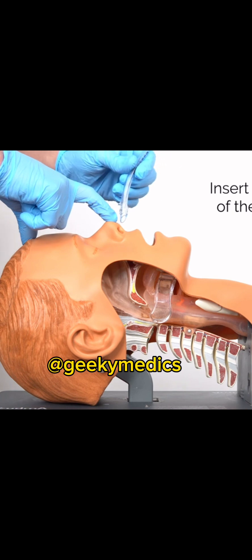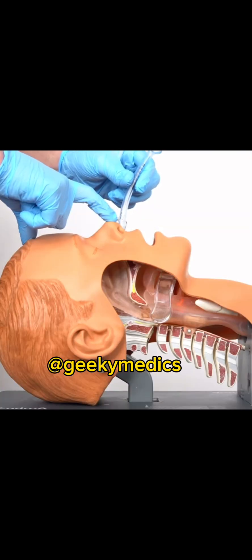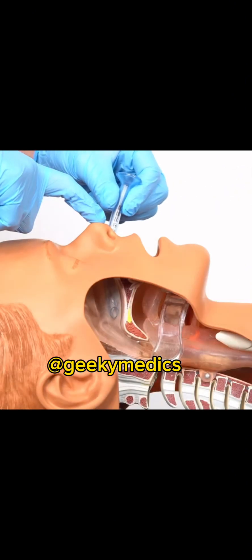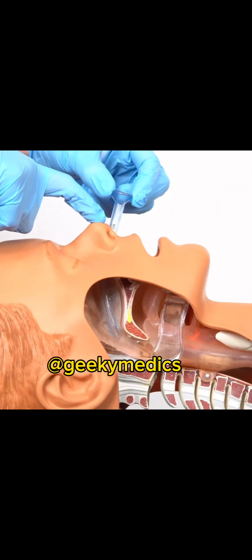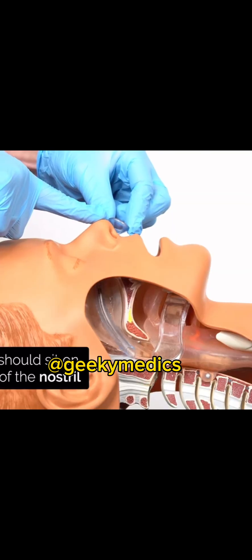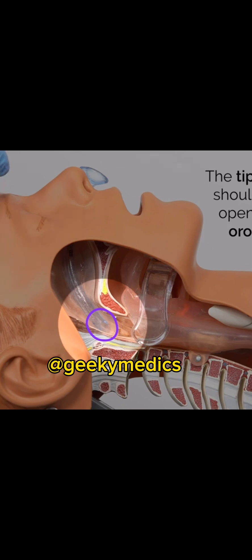Then we're going to gently insert the tip into the nostril, heading downwards, gently twizzling the tube, letting it gently seat itself in. Keep pushing and gently twizzling until the flange sits comfortably on the outside of the nostril. You can see on the side cut where the tip of the tube is. If the tube was too long, the patient may start gagging or coughing, in which case you'd remove it and replace it with a smaller size.